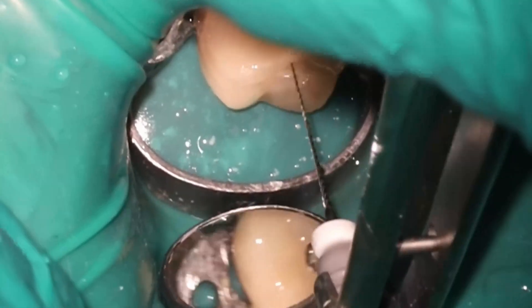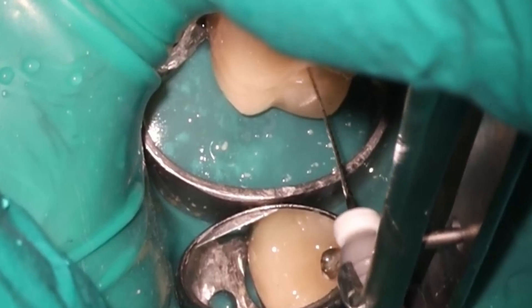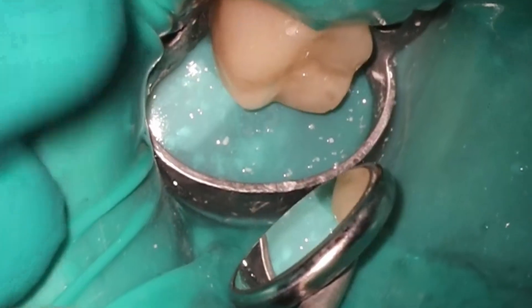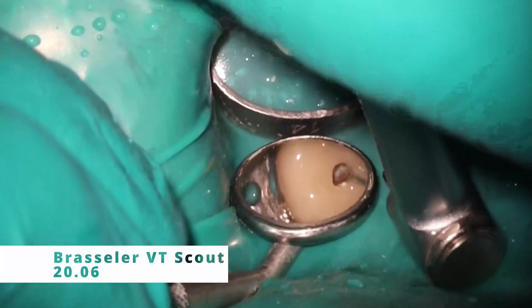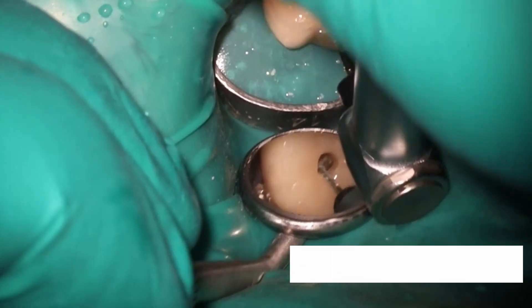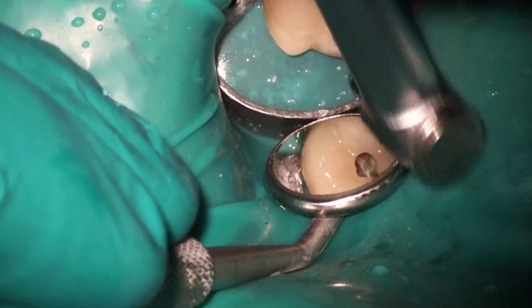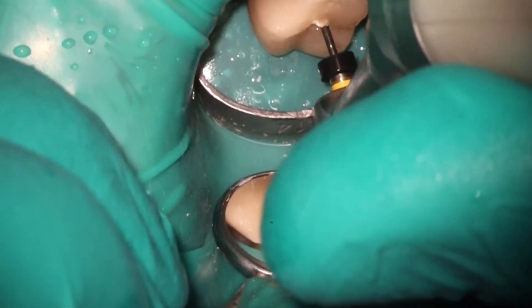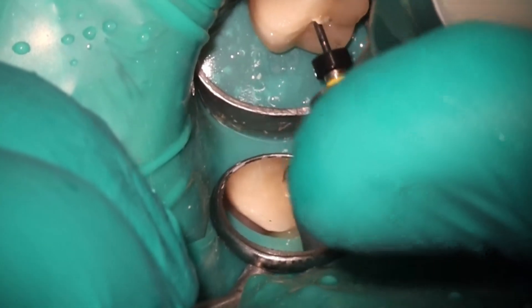I'll post a video here soon about my thoughts at about a month of having the machine. Where it's useful, where it's not useful — the short version is it's been a lot more useful than I thought. I'm going through a lot more handpieces than anticipated and using it on a lot more cases as well. I spent a lot of money on it, so I'm happy to say that it's been worth the investment.